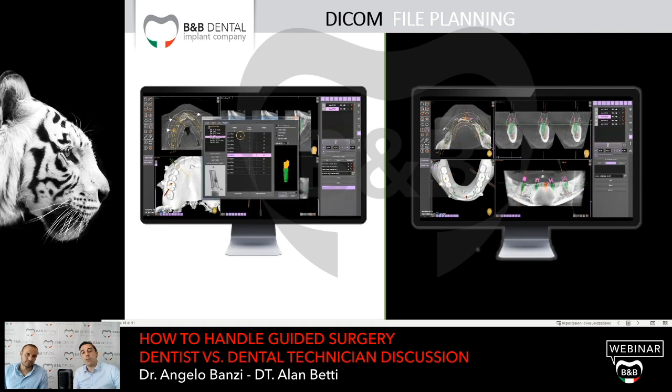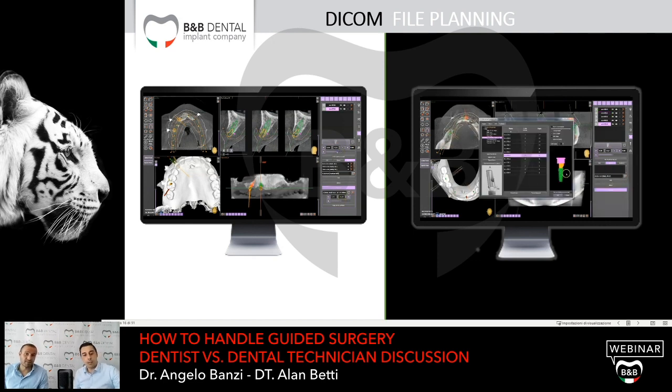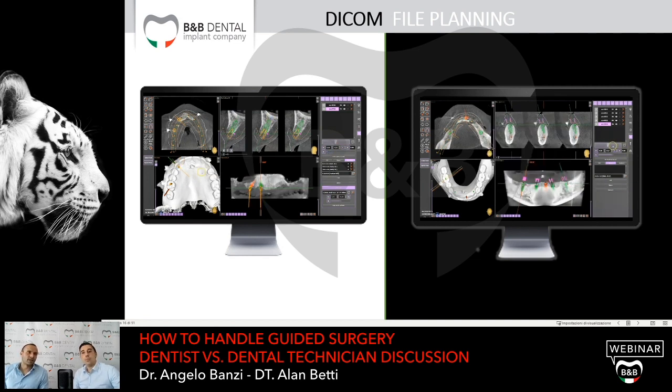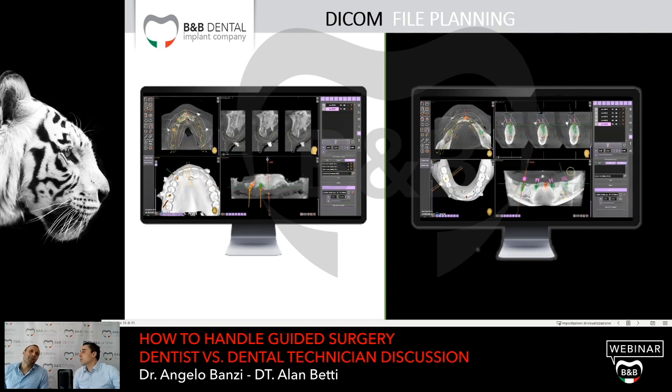And to put the implant in an aesthetic and functional position. This is really very important. And again, check, as you can see from this image, I'm also checking for the sleeves.